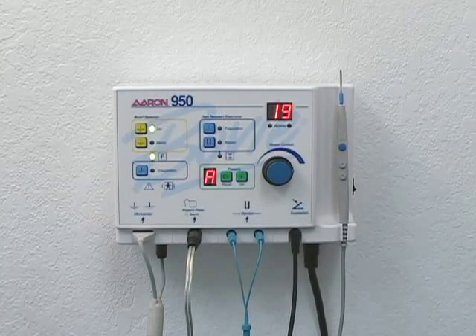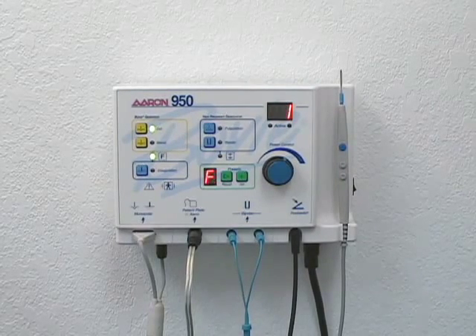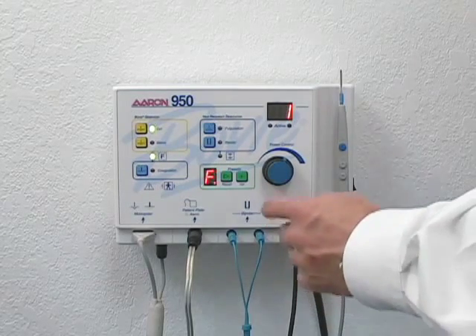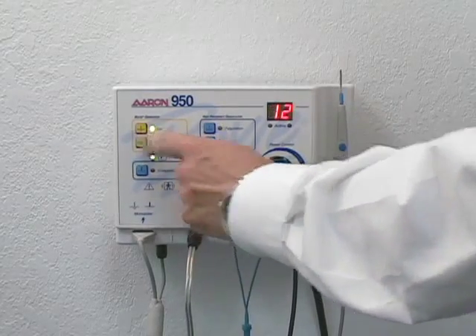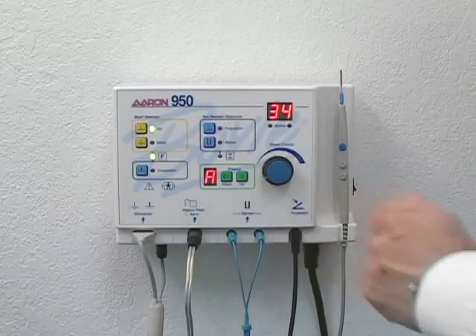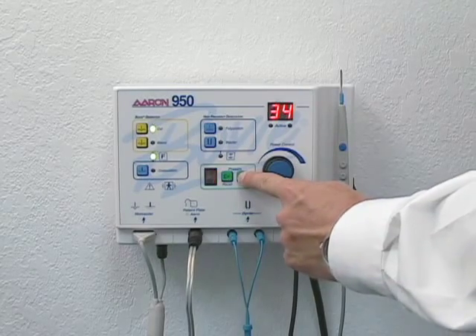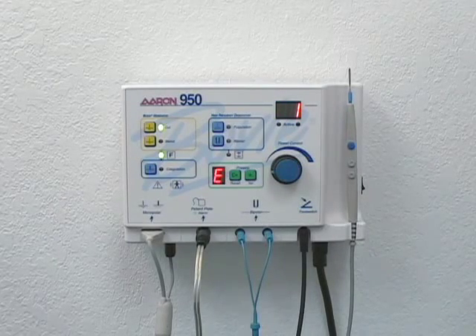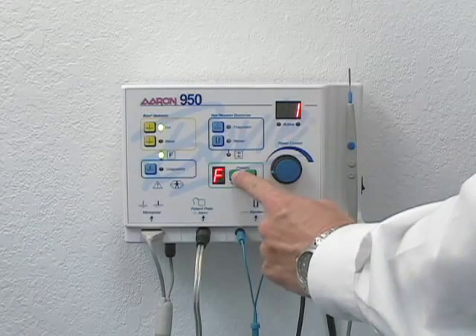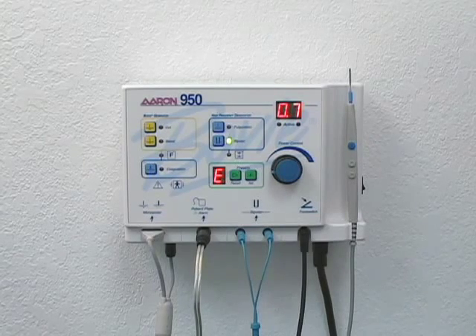The ARIN 950 incorporates six user-defined presets for easy recall of frequently used settings. To create a preset, select the desired letter using the recall button, then select the desired mode and power settings. To store the settings, press and hold the set button for two seconds. The preset letter will blink to indicate that the settings have been stored. To recall a user-defined preset, simply press the recall button until the desired letter appears in the display. A blinking red light in the lower right-hand corner of the preset window indicates the unit is not currently operating in a user-defined preset.